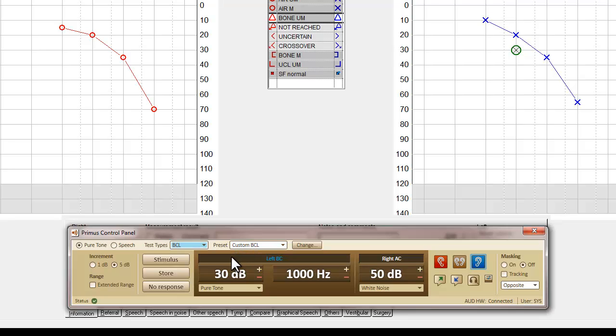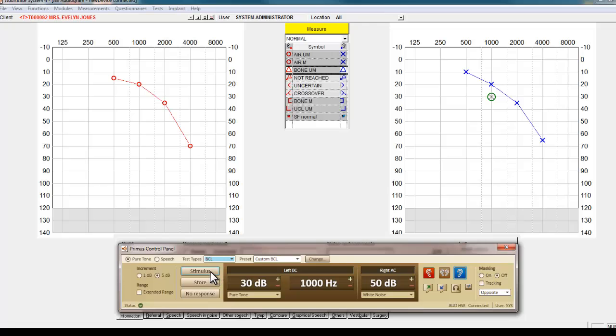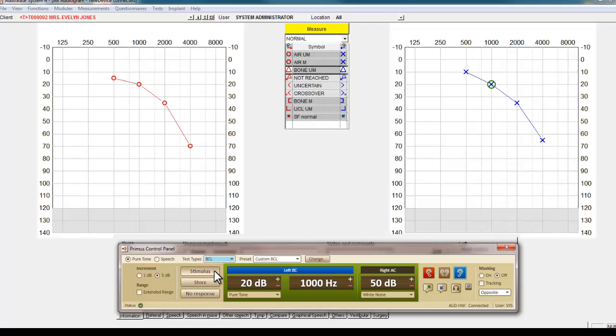You will see that the ear being tested is displayed in the stimulus presentation bar. The results will be stored on the corresponding graph. This can be changed by selecting the icon depicting the ear you are using for bone conduction tests.